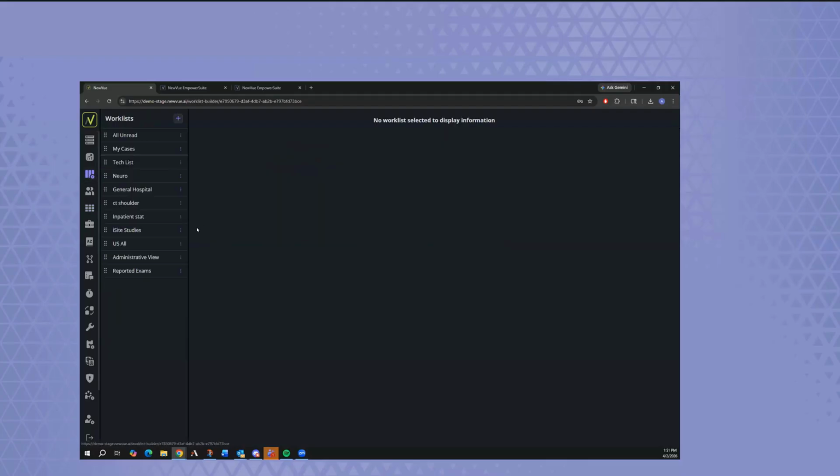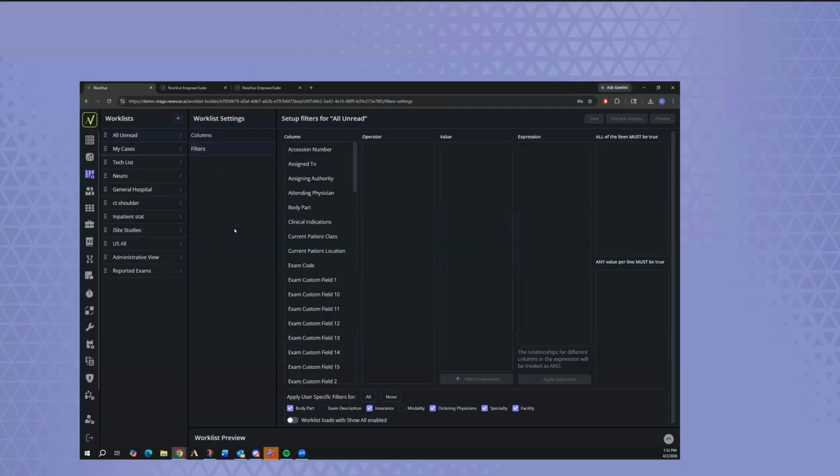And then to tie that together, to solve that problem with the prostate and thyroid procedures, a traditional solution might be one of 2 things. You can make an all ultrasound work list and have one of the staff ignore the exams they don't read, but that leads to clutter, that leads to mental burden, and causes problems with workflows like AutoNext. The system has to know that you're not going to read those, so it doesn't give them to you. So there's lots of issues with that.